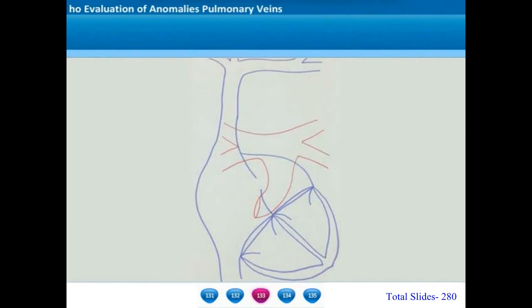A cartoon example of coronary sinus TAPVC. All the four pulmonary veins converge into the dilated coronary sinus and enter into the right atrium. The systemic cardiac output is maintained by the flow of the blood from the right atrium into the left atrium through the fossa ovalis ASD.